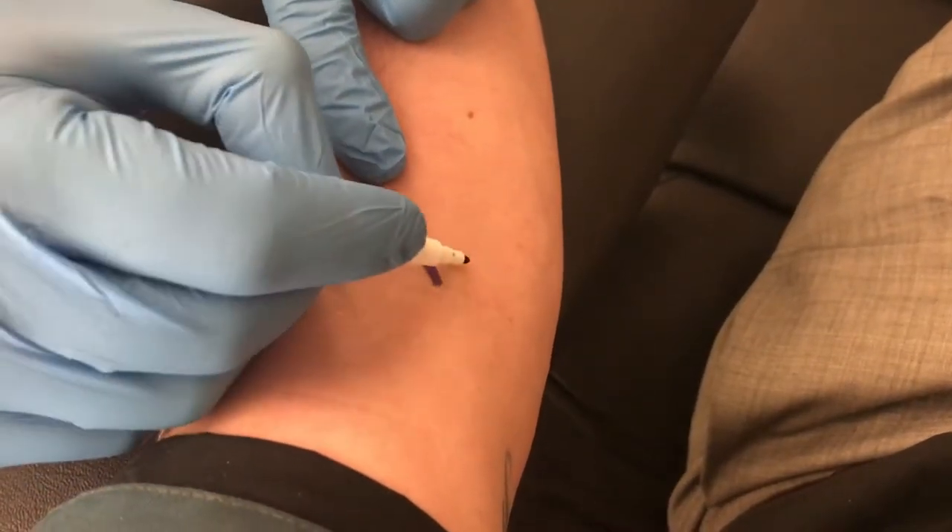At this point they check your blood pressure to make sure everything's good to go before they move forward. Then this is the part where they mark the vein so they know exactly where to stick the needle when that time comes.